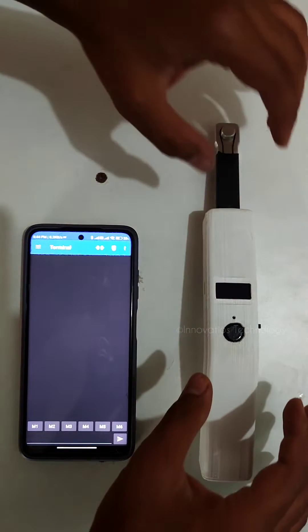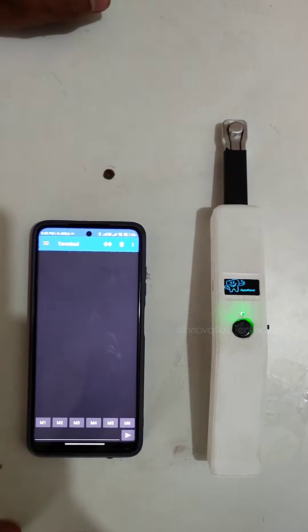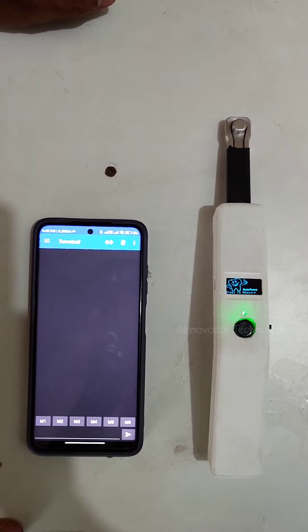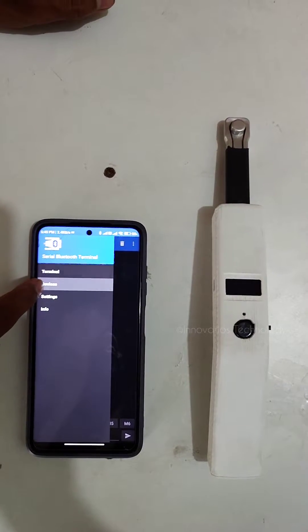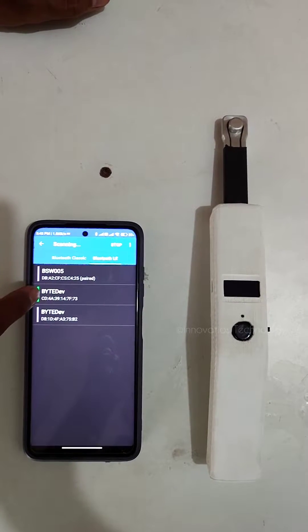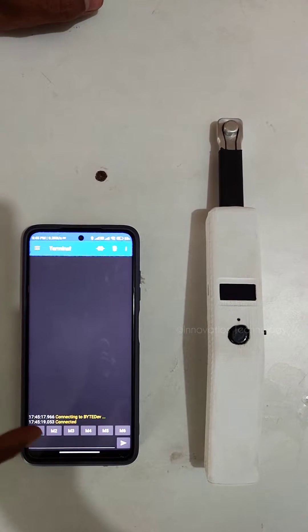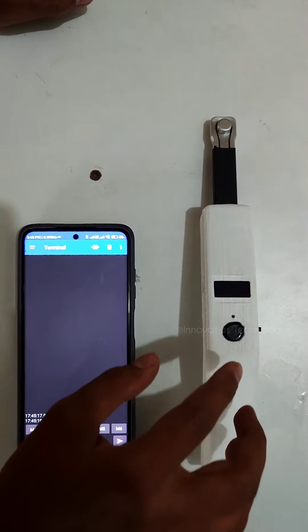To power on the byte device, slide it down and wait for three seconds. You can also open the serial terminal application, go to devices, turn on your Bluetooth, and click scan. You will see the byte device listed — just connect to it. The device is always in sleep mode by default.